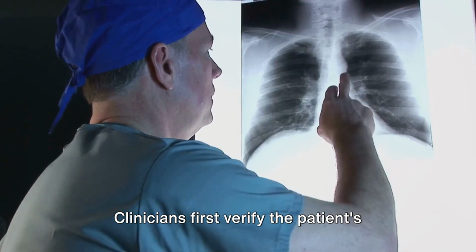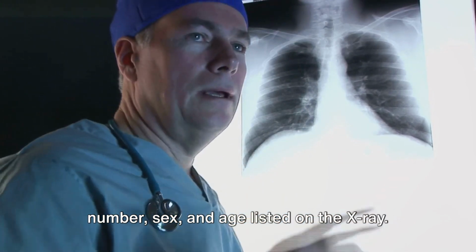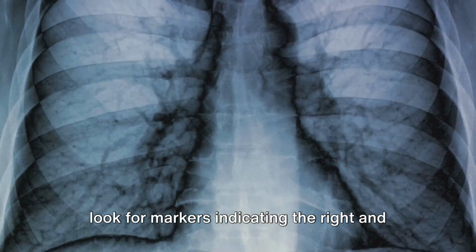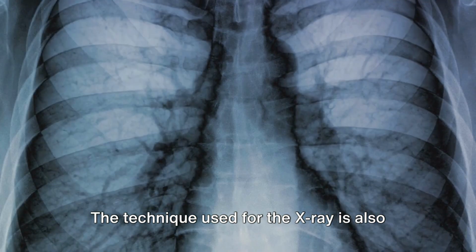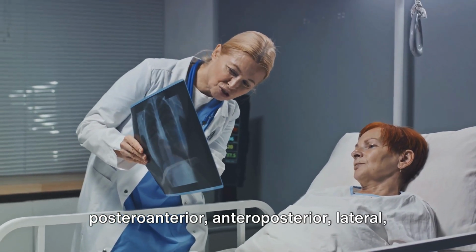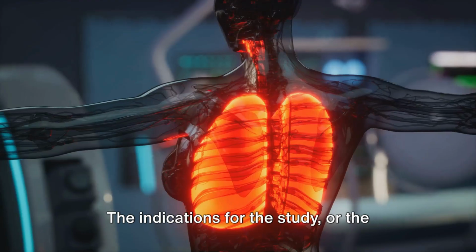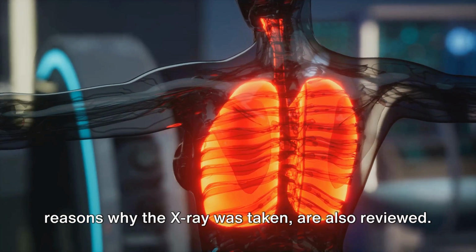Clinicians first verify the patient's identity using the name, medical record number, sex and age listed on the X-ray. They then check the date of the exam and look for markers indicating the right and left sides of the body. The technique used for the X-ray is also noted, such as whether the view was postero-anterior, anteroposterior, lateral, and whether the patient was supine or erect during the exam. The indications for the study, or the reasons why the X-ray was taken, are also reviewed.